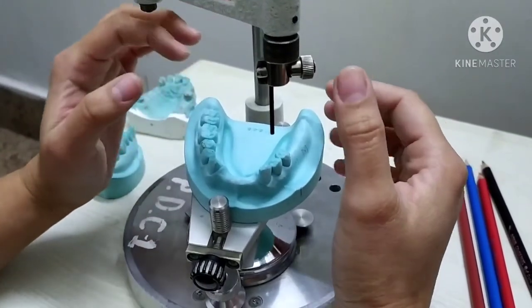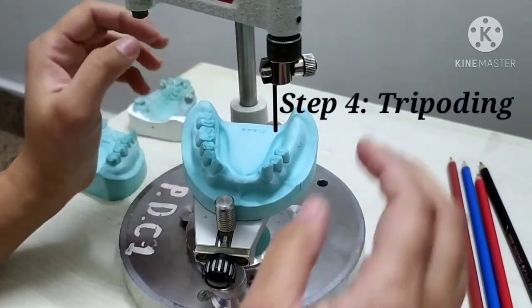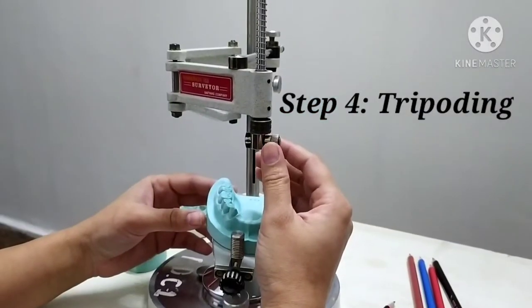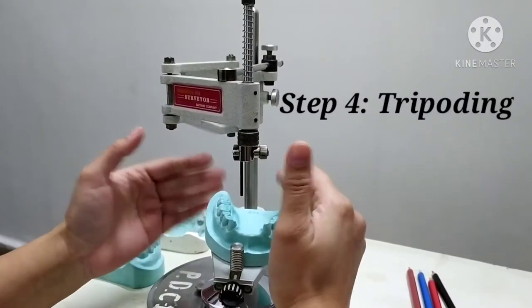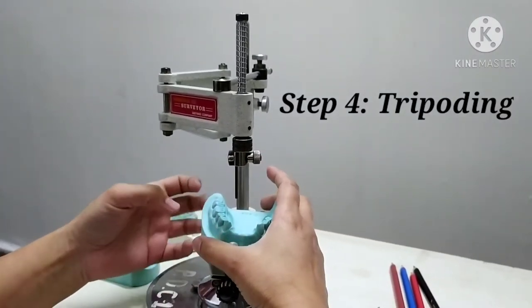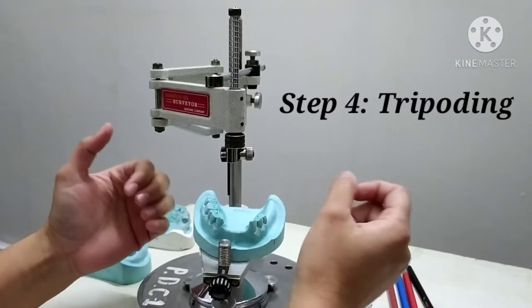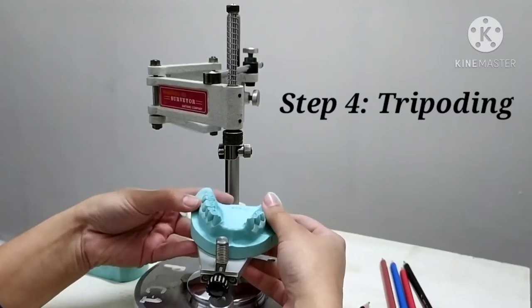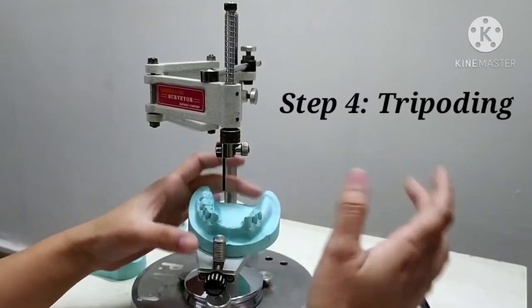The fourth step is also important. After the final tilt of the cast has been selected, it must be recorded so that the cast may later be repositioned precisely. This procedure of recording the tilt of the cast is known as tripoding. The purpose of tripoding is to copy or duplicate the tilt given to the diagnostic cast onto the master cast. Tripoding can be done by two methods: anatomic or tissue surface tripoding, or art portion tripoding.